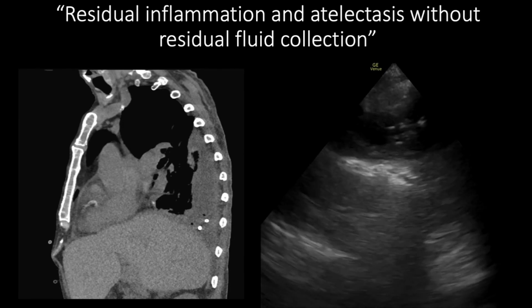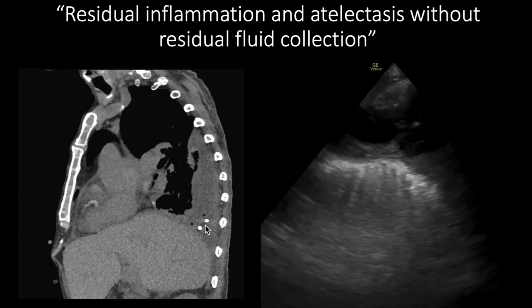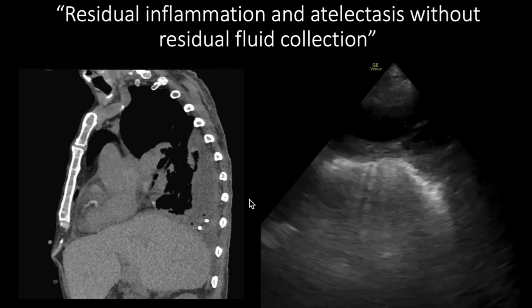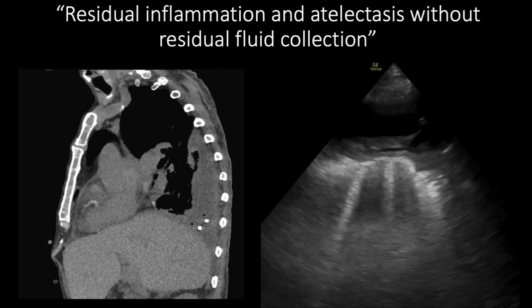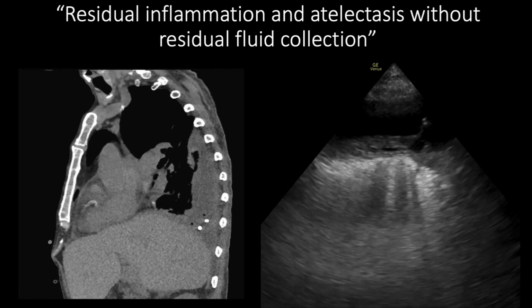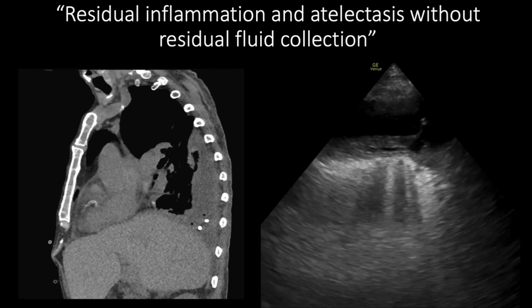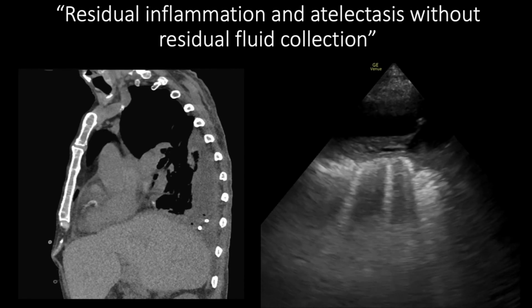So after we convinced CT surgery there was residual pus that wasn't adequately drained by his chest tube, we initiated TPA and we got another 500 cc's of purulent material out of his chest prior to him returning home. Ultrasound is going to be superior often to even CT when it comes to characterizing your pleural fluid, especially in cases like this with empyema.